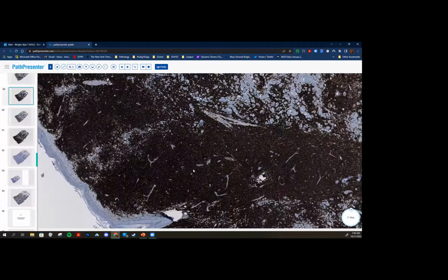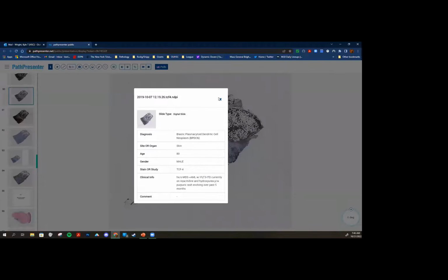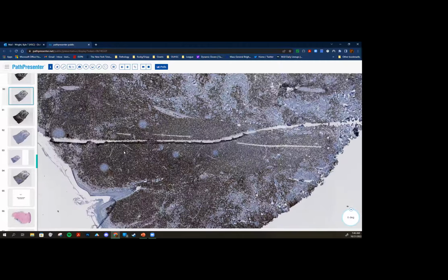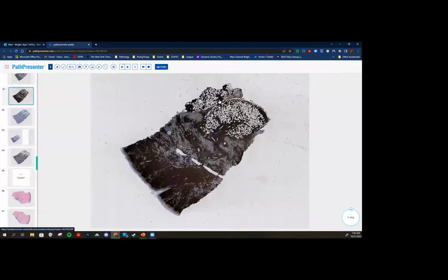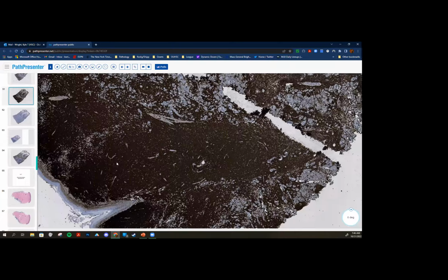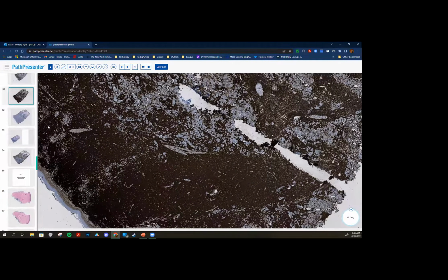Here's CD56, strong and diffusely positive again. This is TCF4, a transcription factor for plasmacytoid dendritic cells, positive. This should be TCL1, and it's a proto-oncogene, in this case, an oncogene. Strong and diffusely positive. Mud brown, it's that look that you get when you have a translocation-induced expression of something.